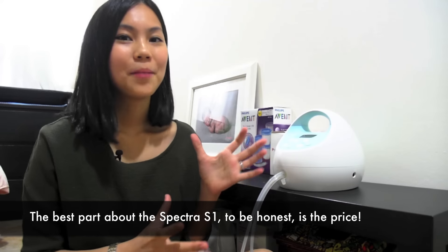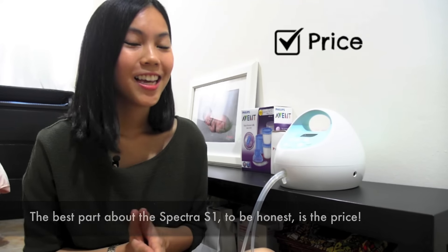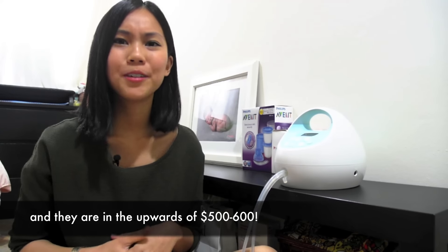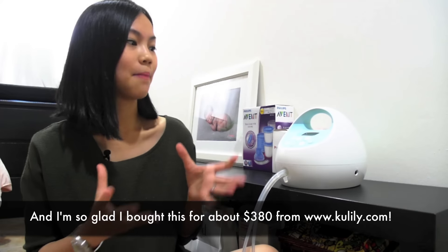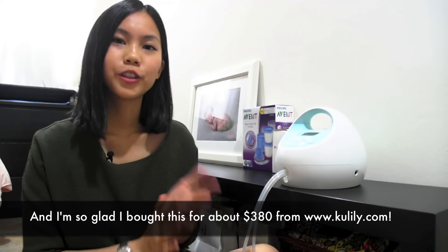The best part about the Spectra S1, to be honest, is the price. I was comparing between so many different brands and they are in the upwards of $500 to $600, and I'm so glad I bought this for about $380 from kulily.com.